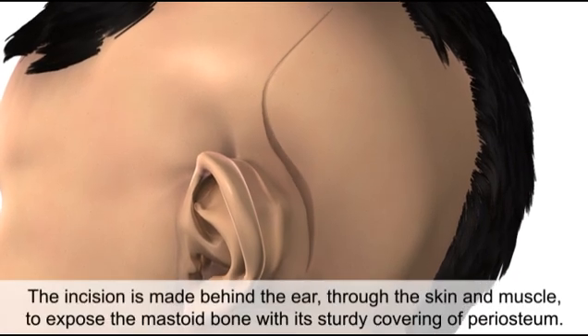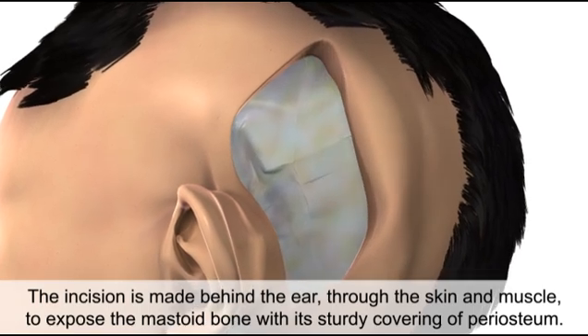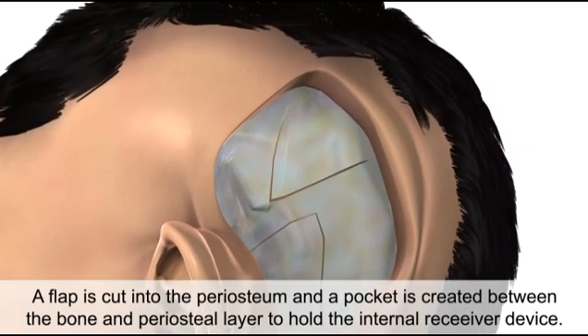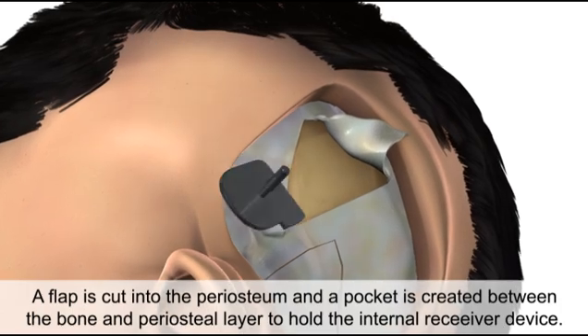The incision is made behind the ear through the skin and muscle to expose the mastoid bone with its sturdy covering of periosteum. A flap is cut into the periosteum and a pocket is created between the bone and the periosteal layer to hold the internal receiver device.